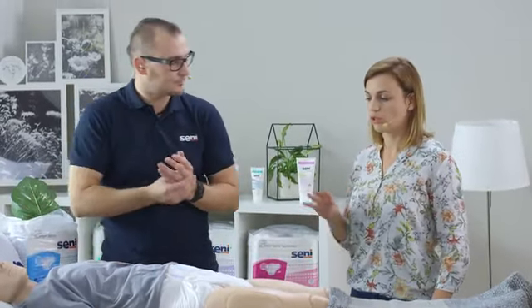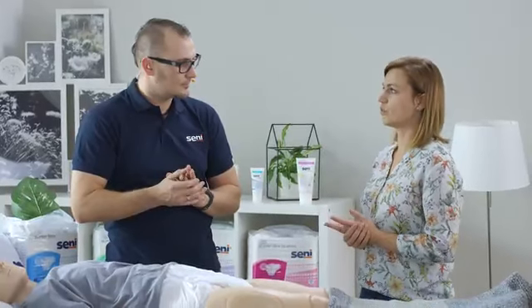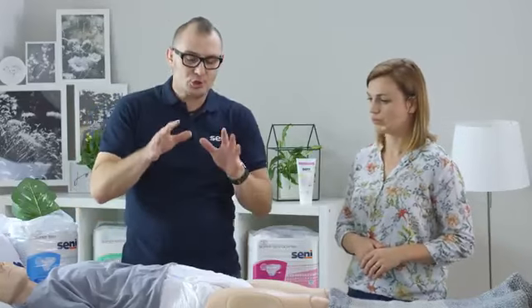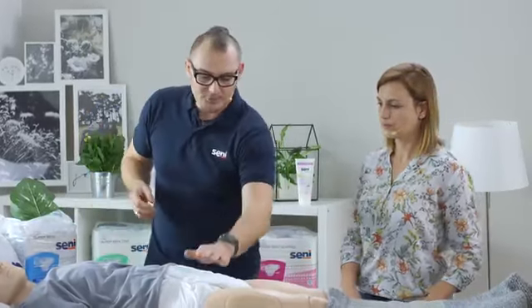Good. So we have mobility. We have absorbency and size. What else is important? What should we pay attention to? What would tell us that the product is of high quality? If we choose the product well, taking into account these 3 elements, now it is worth paying attention to what qualitative features, what comfort does using this product provide.